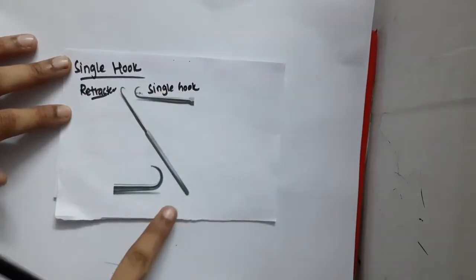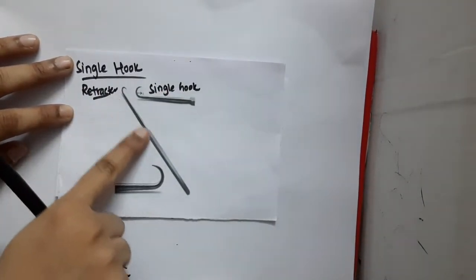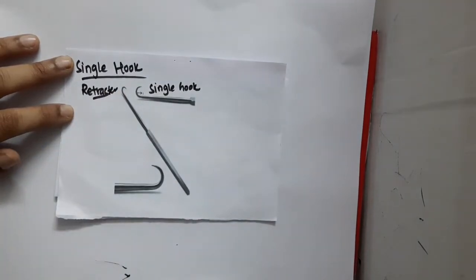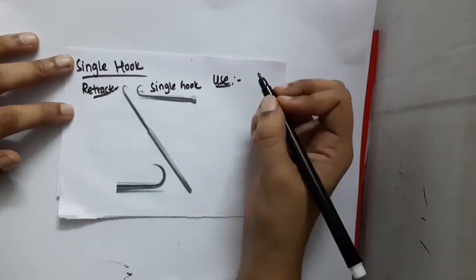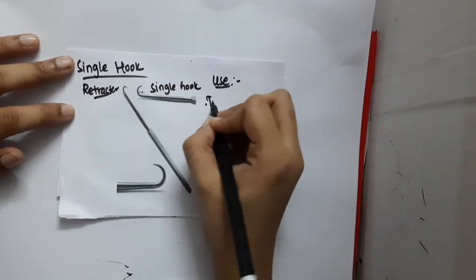You can see there is a handle and there is a blade here. There is one hook, so this is a single hook retractor. So what is the use of the single hook retractor? It is used mainly to retract the edges of the skin.